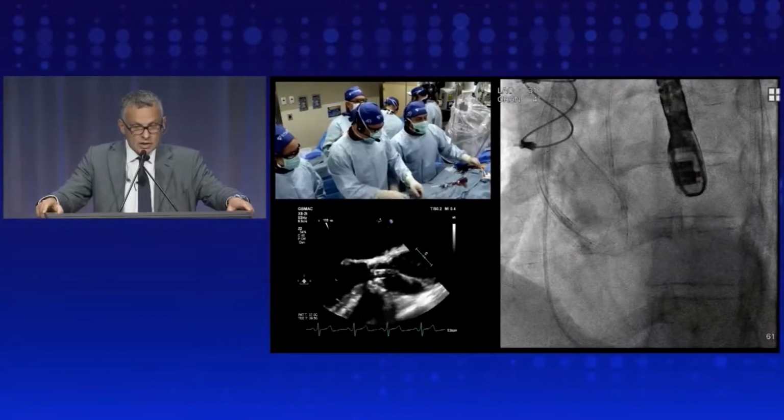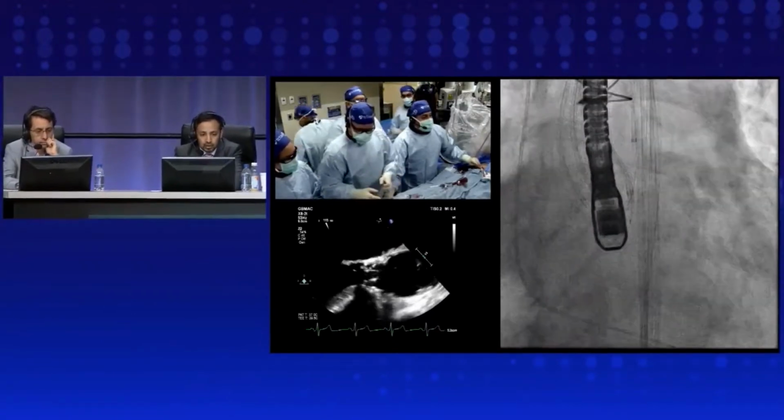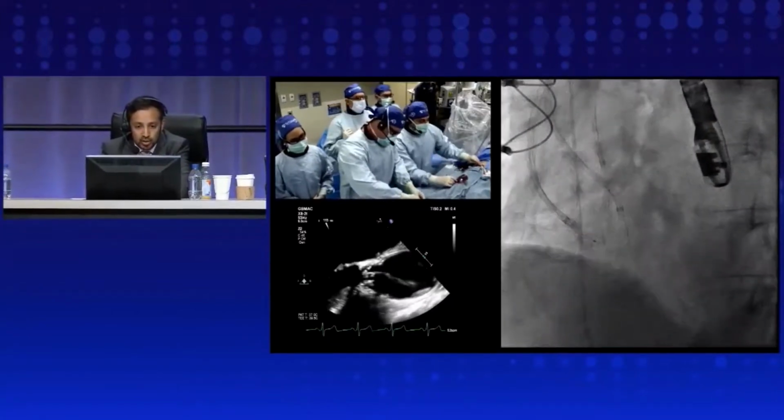Yeah. Danny, this is Samir here. It's graceful when the electricity works, but at the end of the day, they all tear. Basically, we want the two catheters of the cusp, that loop to be closed.